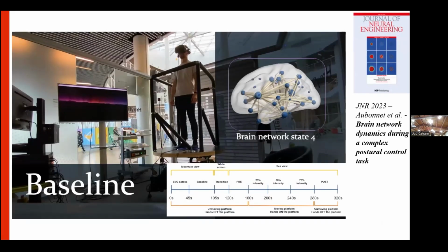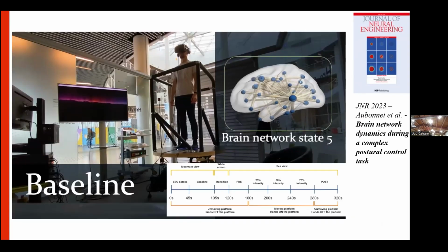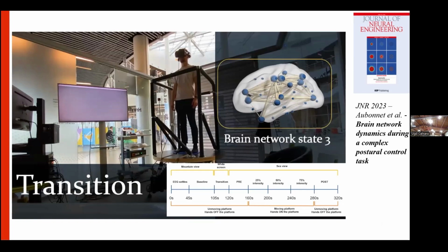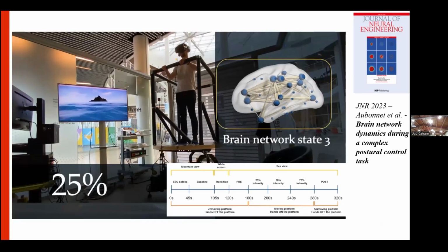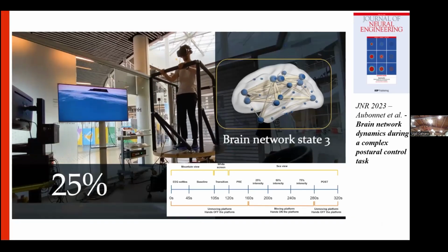So this is what is happening over 200 individuals that are healthy during our experiment. This is a little bit fast-forwarded, faster than it normally is in our experiment, but you can see that the equivalent brain electrical activity, so the interactions between the different brain network states, can be modeled over 200 individuals. And this is the way the transition between the states happens in our experiment.